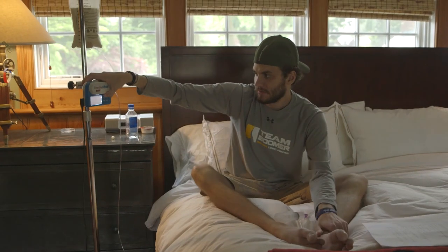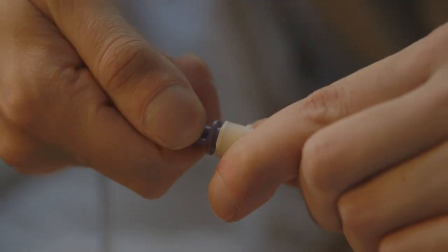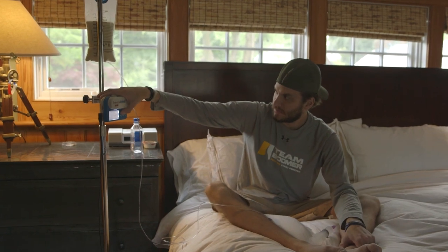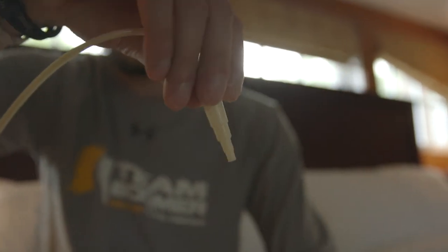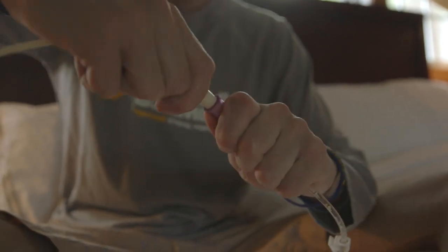Turn the EnteroLite Infinity Pump on and select the desired flow rate. Before connecting the pump set to the extender set, make sure that the white Christmas tree is securely connected to the ENfit connector by twisting clockwise until tight. Prime the line. Insert the Christmas tree into the extension set and twist clockwise until tight. You may now begin the feed.